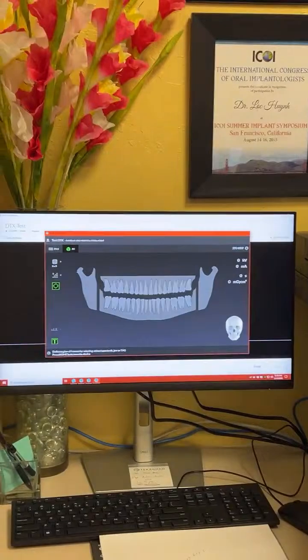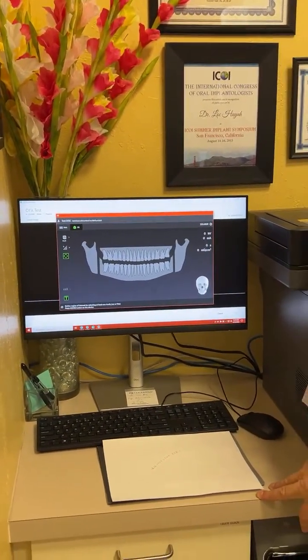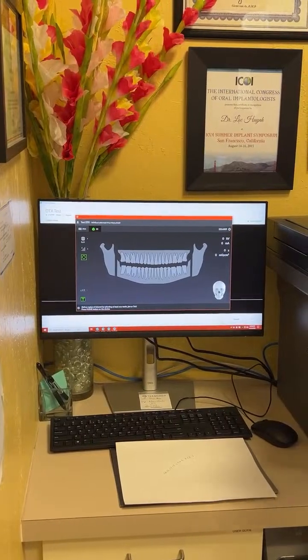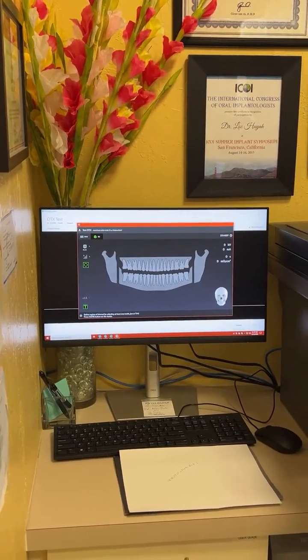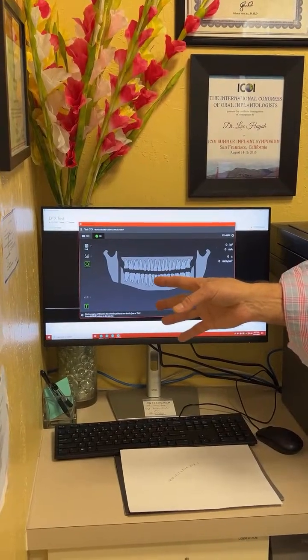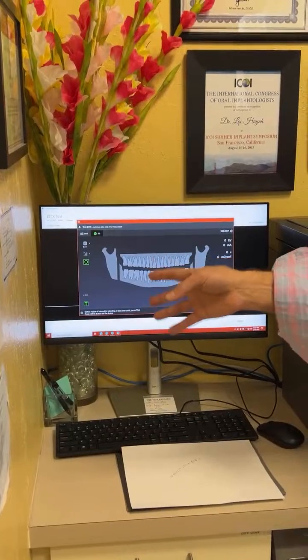And for the 3D, if we tag 3D with the app, how about when we view, can we view from EagleSoft or no? EagleSoft is not able to view 3D volumes. Got it. It never was designed to do that. So the bottom line is you need to use EagleSoft just for 2D and choose these two. And honestly, when you see what this software can do, you're not going to want to use EagleSoft for 3D, even if they could do it, because this is just very powerful. Because it has AI in it.